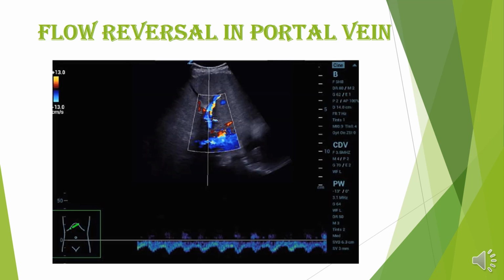And this is the late stage of portal hypertension, when you can see the flow, which should be red, has reversed to blue, and there is reversal seen in this spectrum. Now it's going downwards.